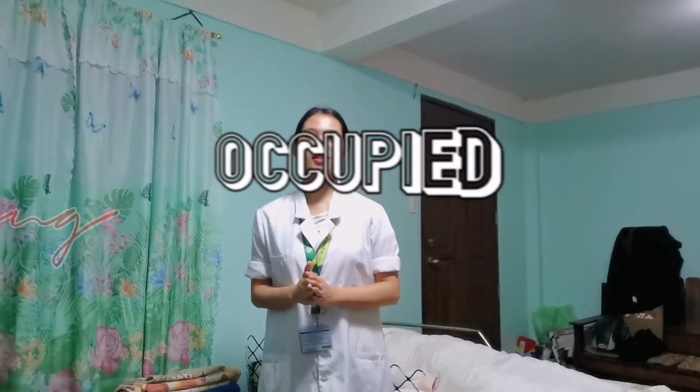Okay, so let's move on to the occupied bed making. Occupied bed is made when the patient is not able to tolerate or not permitted to get out of the bed, or when the patient is already occupying the bed.